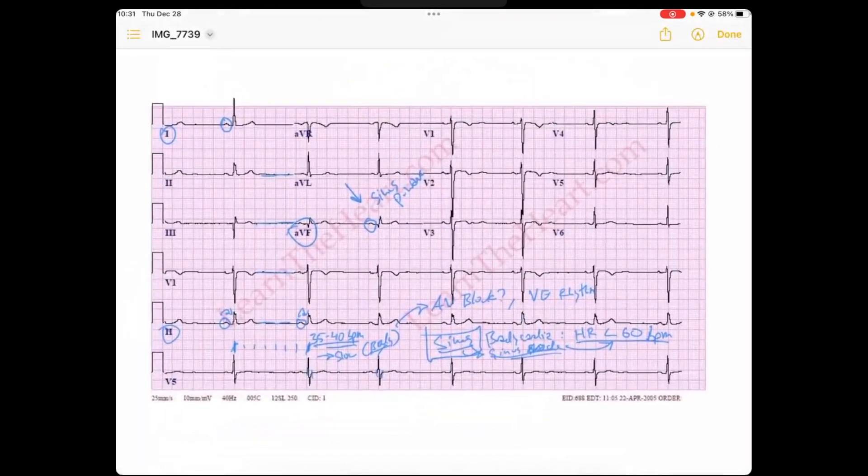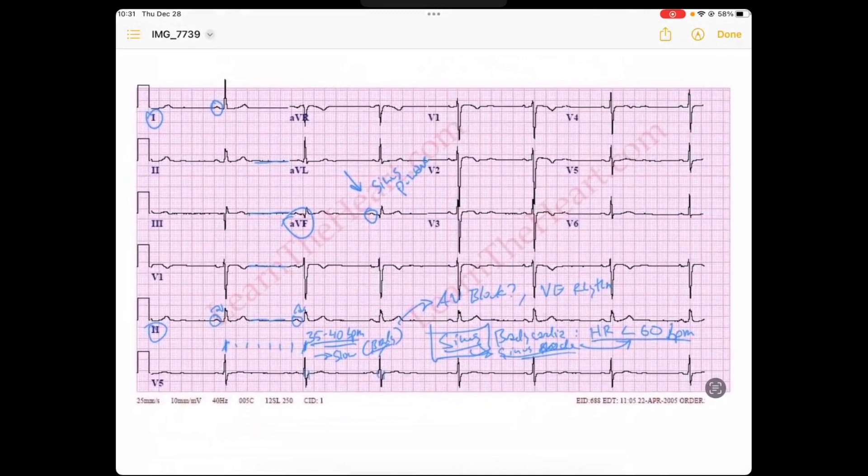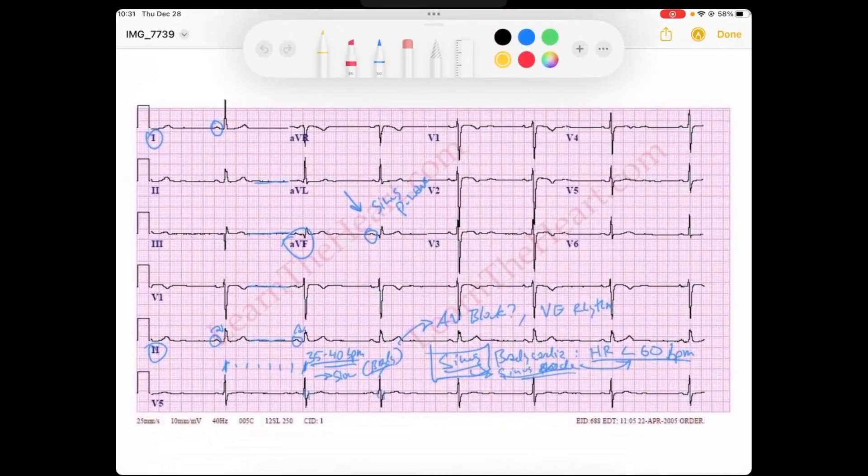So, when I go back to my EKG, I always do that. When I see P waves, where are those P waves coming from? Are they ectopic? Are they sinus? And you correlate that to the behavior, which we know that sinus node behavior is regular, is very predictable. So, in this case, we have a narrow QRS that is being driven by these P waves that are upright in one and upright in AVF.